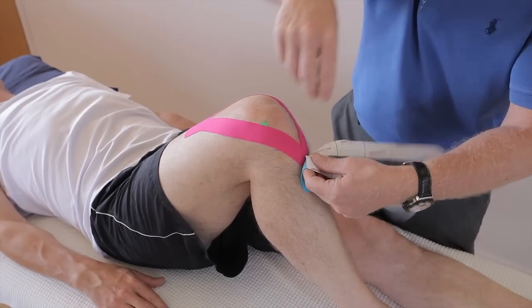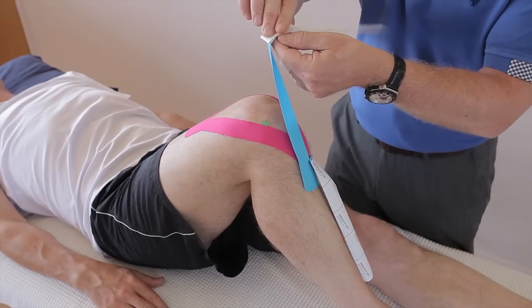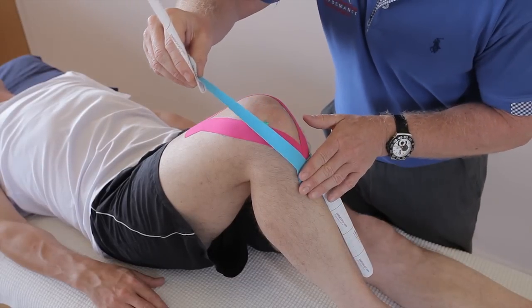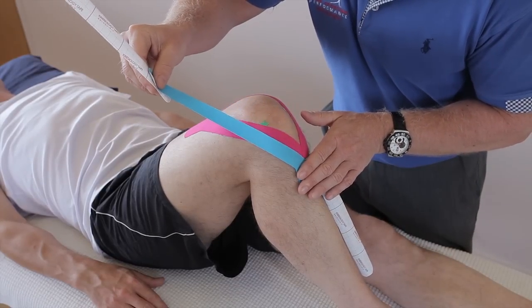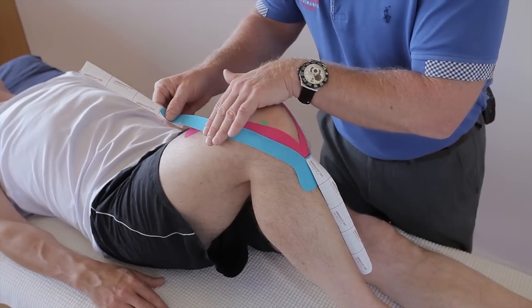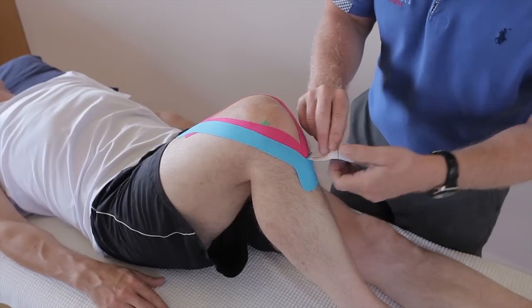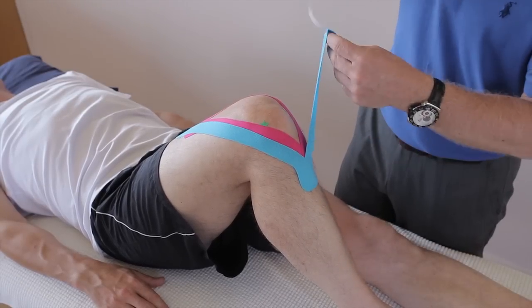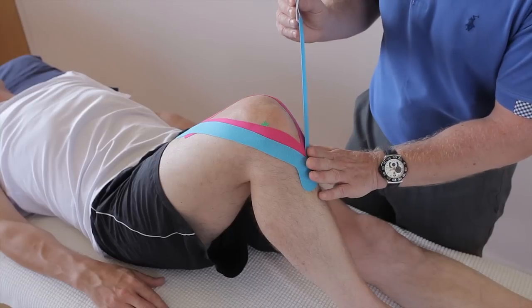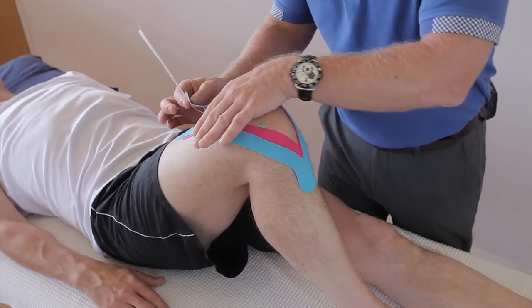Pull and split the back end of the tape. This one is literally going to cross over. Little to no stretch — again it's very tempting to pull it — so cross over, and it'll finish on the superior part of the first tape. Do the same on this side: little to no stretch, just mould that around and finish.